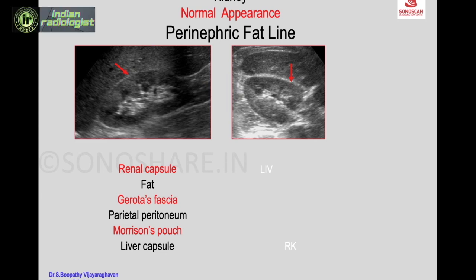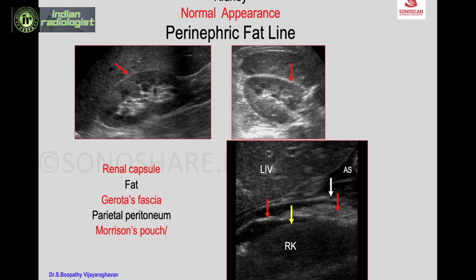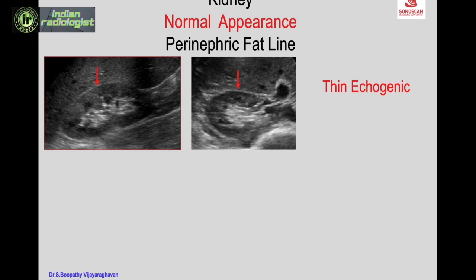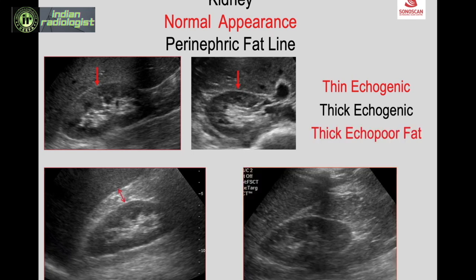The perinephric fat line may not be distinguishable in a normal patient, but when there is abnormality or fluid collection, the layers are seen separately: the renal capsule, perinephric pad of fat, Gerota's fascia, parietal peritoneum, Morrison's pouch with fluid in ascites, and the liver capsule — all made out in a case of viral hemorrhagic fever with fluid between the layers. The perinephric fat line is usually thin and echogenic, but can also appear thick and echo-poor depending on the fat's fibrous tissue content.